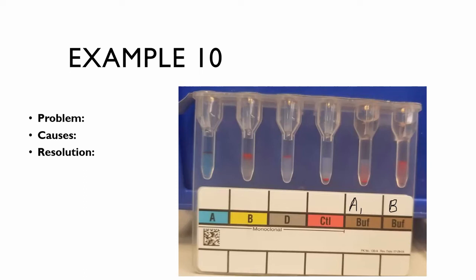And this is our last one. It's kind of hard to see because of the background. It's hard to take pictures of these. So, missing reaction or weak reaction. Or missing or extra.